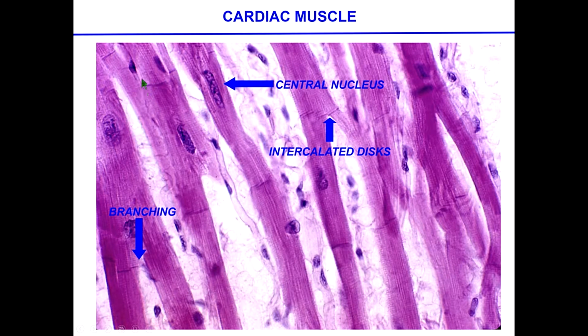The shape of this fiber, for instance, is kind of funny compared to this other one that looks more like a straight fiber from the skeletal muscle. In any case, the nucleus is centrally located, and here is an example of branching, another example of branching, and this one actually happens with the intercalated discs. When you look at references in the literature about the discs, 50% of the population use DISK, and the other 50% DISC. So call it whatever you want, it means the same thing. Questions?